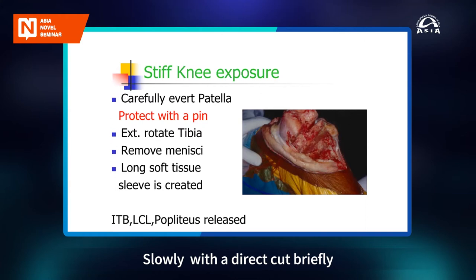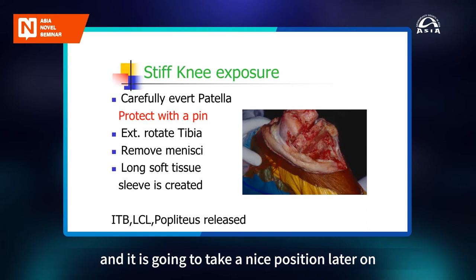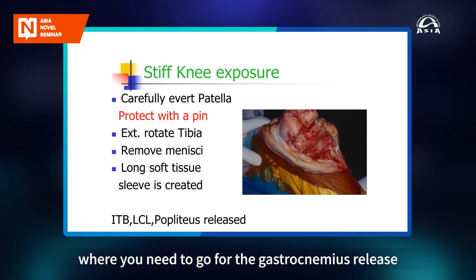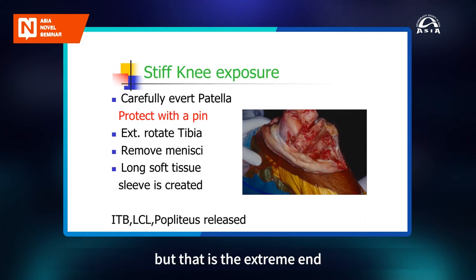Slowly, with a diathermy preferably, remove the menisci and create a nice long soft tissue sleeve from the femoral side down to the tibia. There is no problem here because this is going to go back and it is going to take a nice position later on. In these cases, you don't have to worry. If you are still not able to release, that is the time you have to think of making either pie crusting or release of the ITB iliotibial band, lateral collateral ligament, and very rarely in the last, the popliteus tendon. These days, you rarely find a situation where you need to go for the gastrocnemius release, but that is the extreme end.